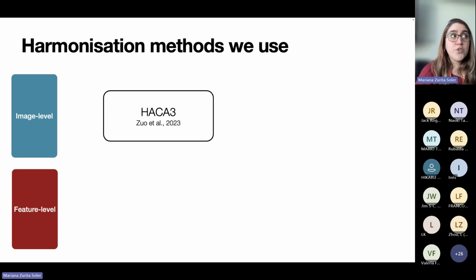They use an autoencoder deep learning method that tries to disentangle the biological information from the information that comes from the contrast of the image, and with this separated information tries to produce a new image that has only the contrast information closer to the original, while keeping all the biological information.